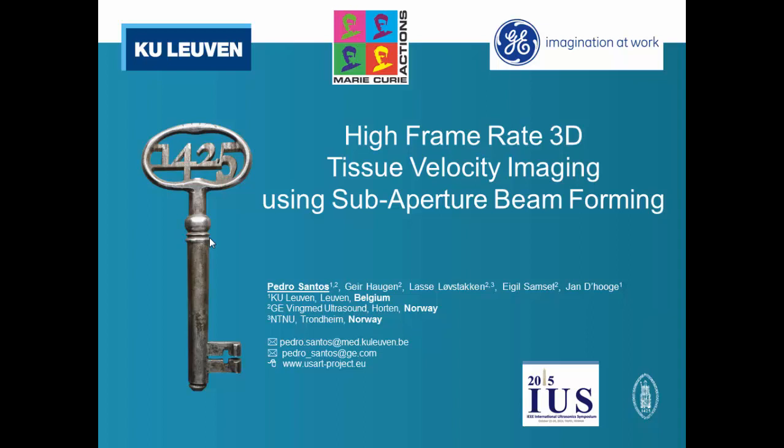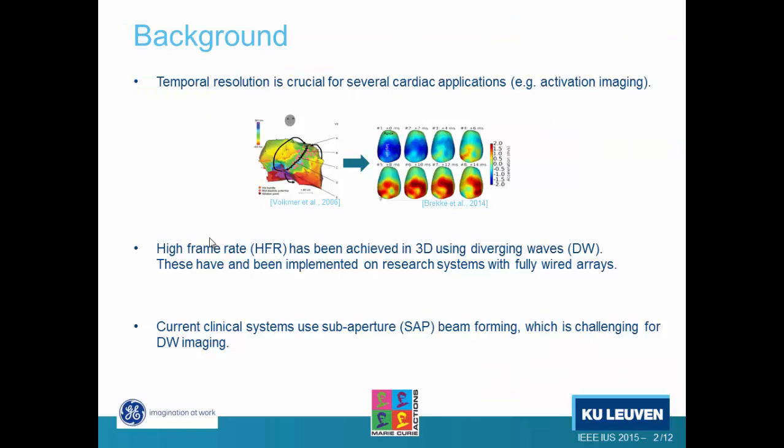So I'm Pedro. I'm a PhD student at KU Leuven and GE Vingmed in Norway. And I'm here today to talk about high frame rate 3D TDI. And the motivation for this work is the same as most of you in this room. We want to go faster. And we want to go faster because that would allow us new applications.